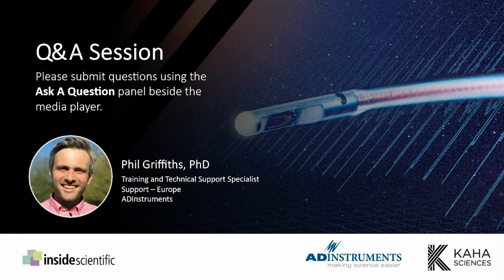Okay, great. Another question here. In order to measure left ventricular pressure, where do you need to secure the transmitter? So the body of the telemeter would be implanted in the abdominal cavity, and then the catheter is implanted in the left ventricle via the apex of the heart. So you go in through the diaphragm.